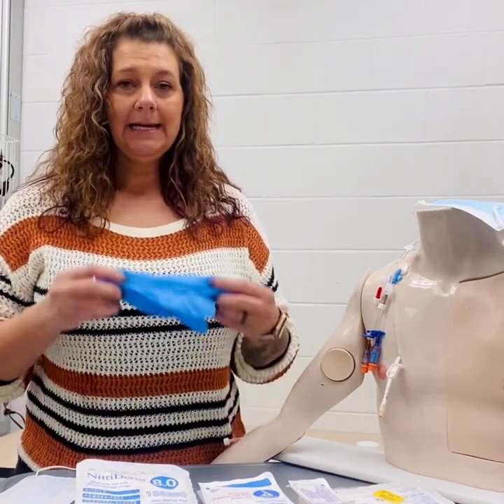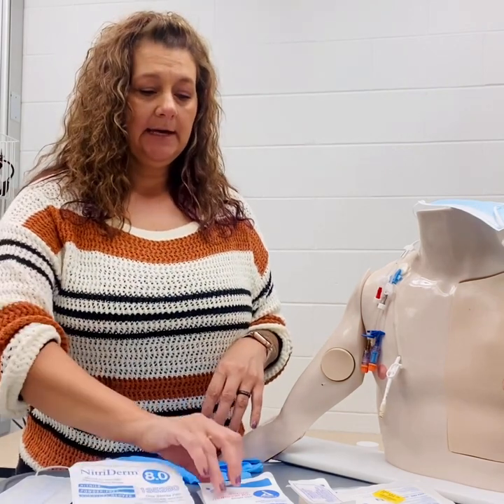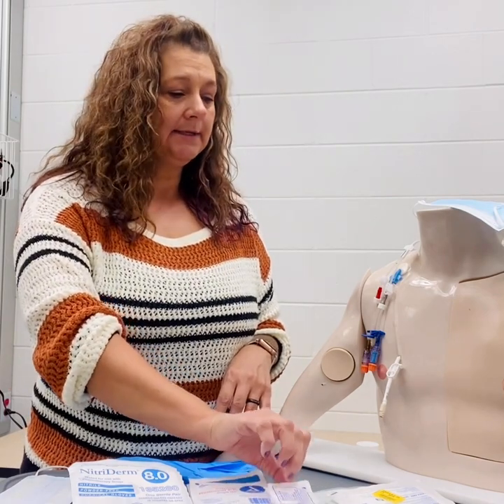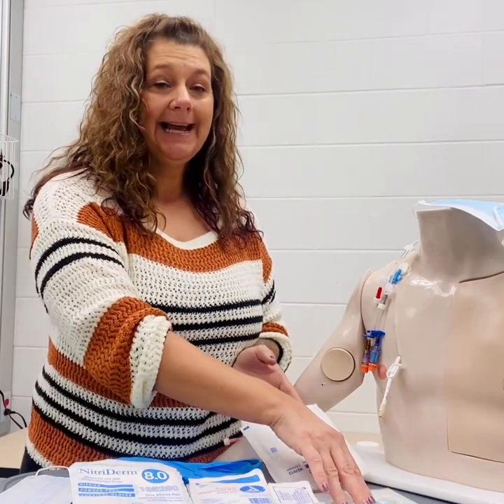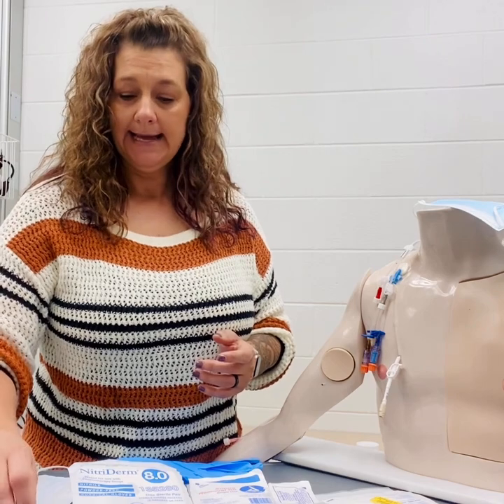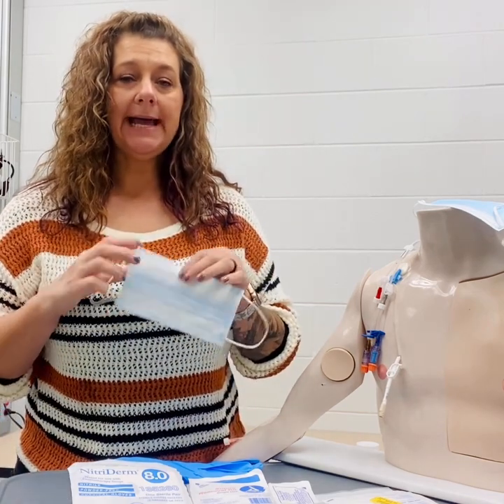For a central line removal, we'll need clean gloves, sterile gloves, a suture removal kit, your chloroprep or chlorhexidine wipes, sterile gauze, a sterile Tegaderm or transparent dressing, sterile tape, and we also need a mask for ourselves and one for the patient.